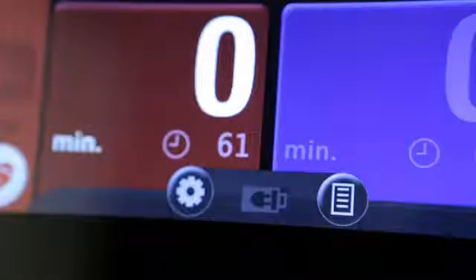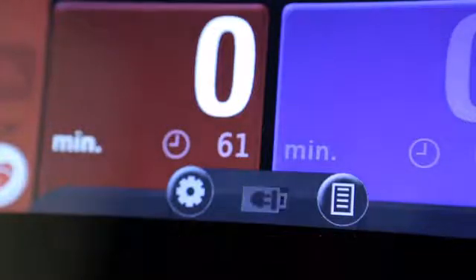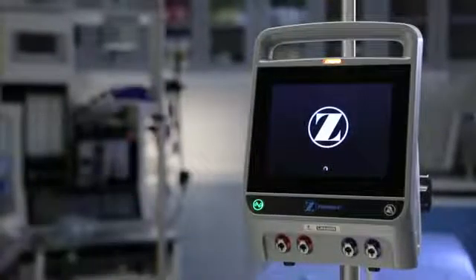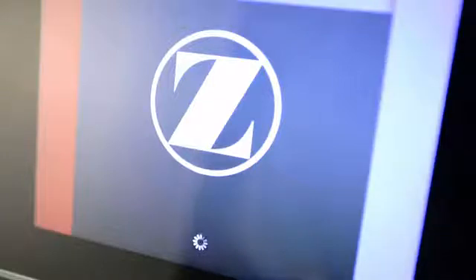If AC power is lost for any reason, the AC indicator light will go off, but the unit will remain powered for up to six hours via the battery backup. When operating on battery backup, a battery status icon appears and displays the battery's current capacity. When the ATS 4000 is turned on, the unit automatically runs a self-test to check system hardware and software.